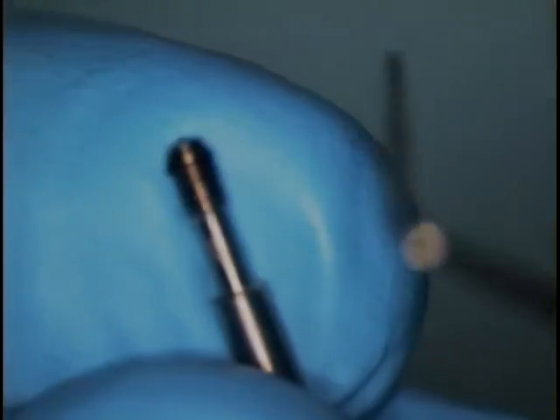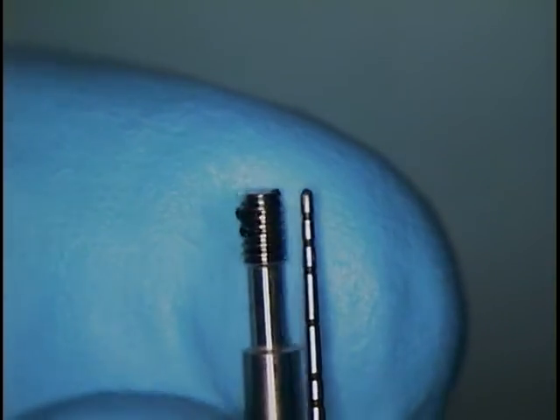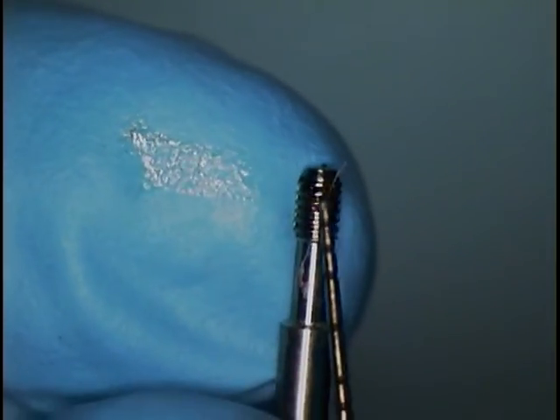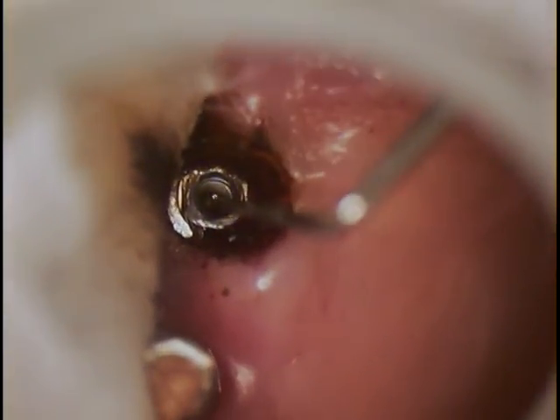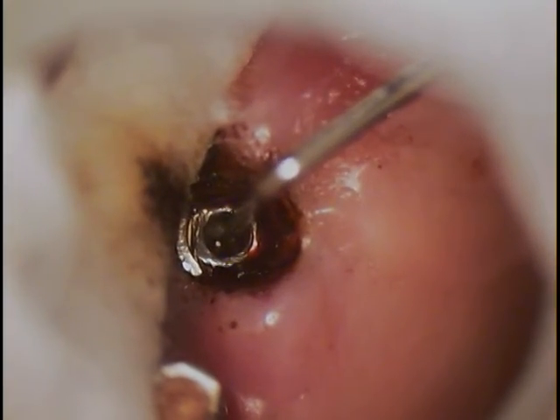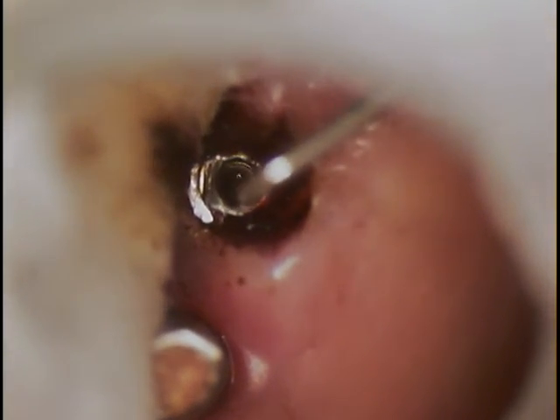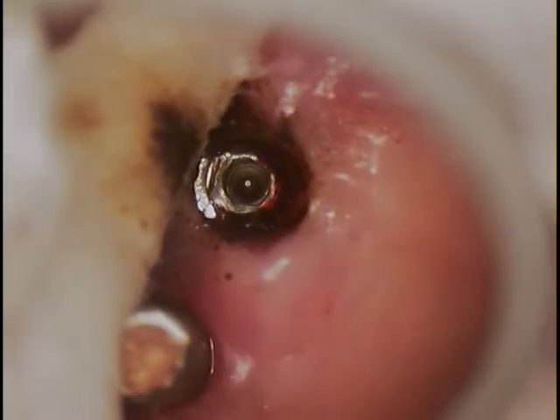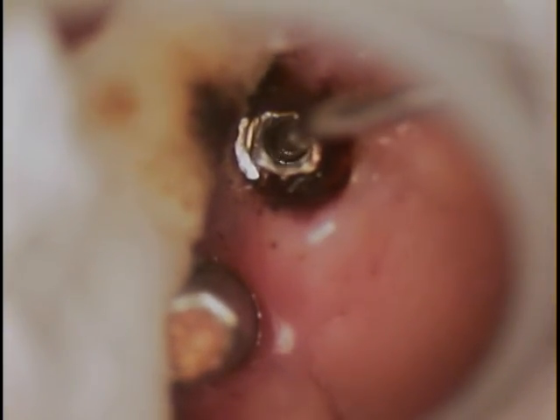I'm going to measure the length of the perioprobe and the length of the screws. We're looking at three millimeters in length. We'll rinse that in peroxide. I'm going to measure the depth, and it's three to six millimeters, so we could afford to go a little bit further down. Micro suction. There's some obstruction down in there, still stuff in there.